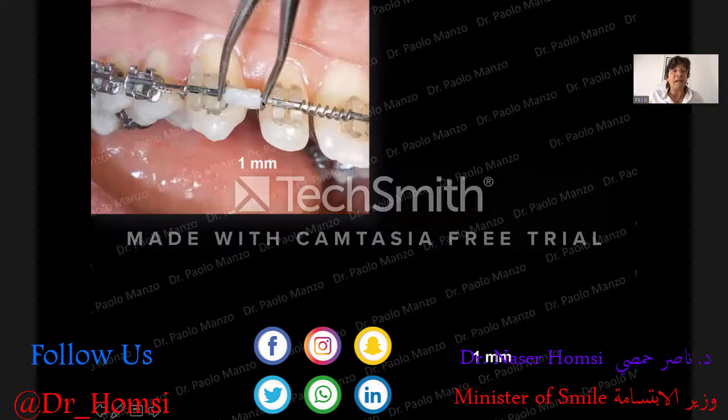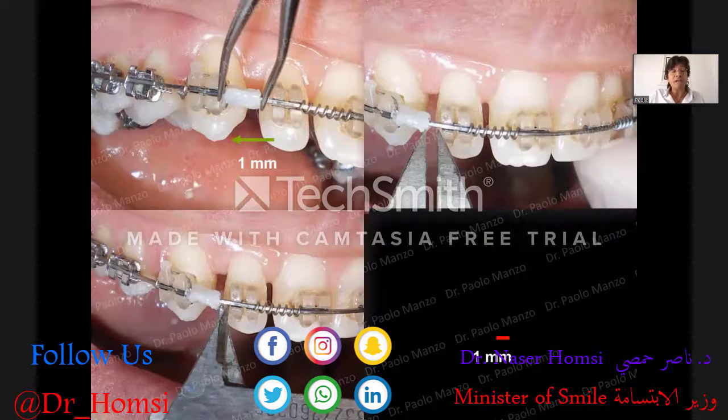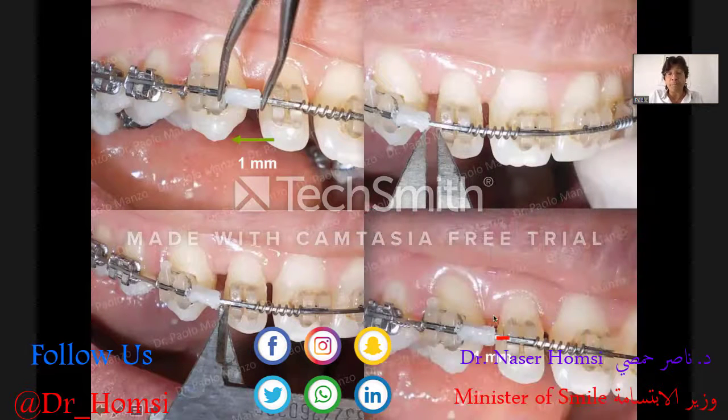Another way to stabilize the movement of a tooth, like this lateral incisor, sorry, I want to move distally, and I don't want to move more than 1 millimeter. So I can place some flow composite, and the flow composite can stop the movement of the lateral incisor, avoiding moving more than 1 millimeter distally. Okay?